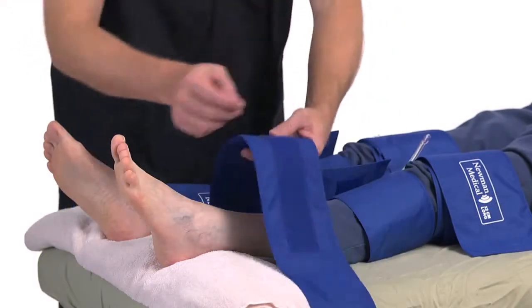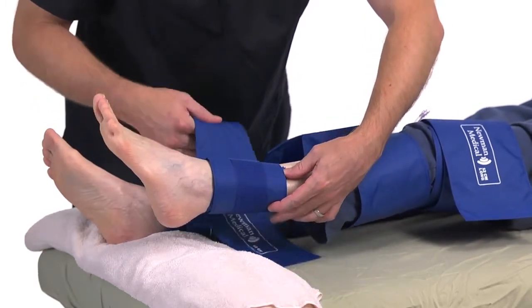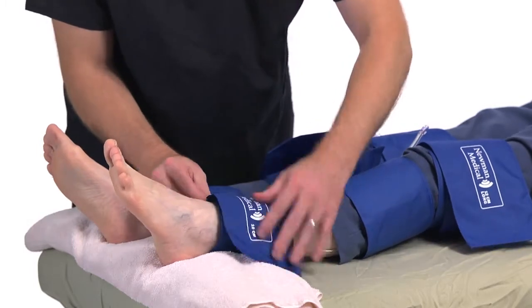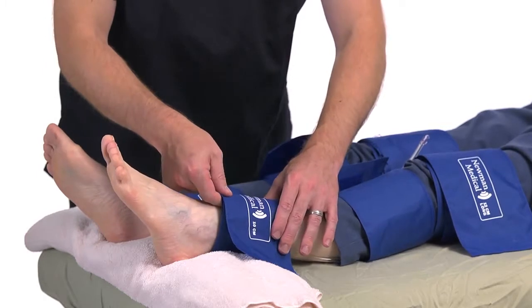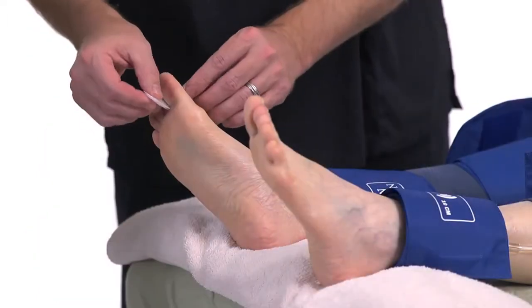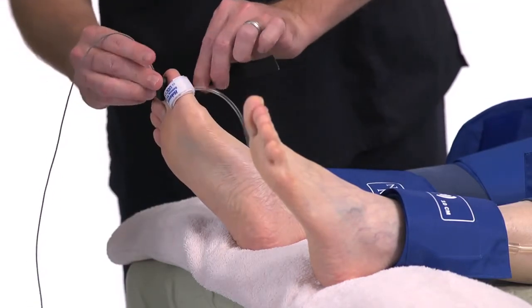At the ankle, start by wrapping the bladder portion first. Place the cuff under the ankle and wrap it around the ankle, holding it in place with one hand while wrapping it with the other. Try to wrap it straight. You can rotate it around to get the hose out of the way of the artery. When wrapping cuffs on the legs, the patient may try to hold their leg up to help, but ask them not to, because when they relax their leg the cuff may loosen. When wrapping digital cuffs on the toe, try to wrap it down on the toe far enough that you will still be able to get the PPG probe on the end of the toe.